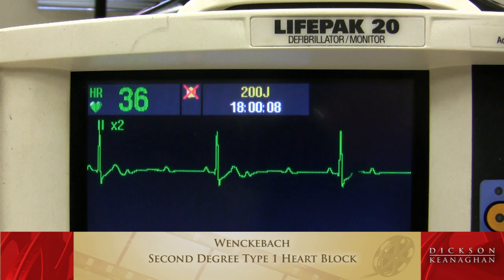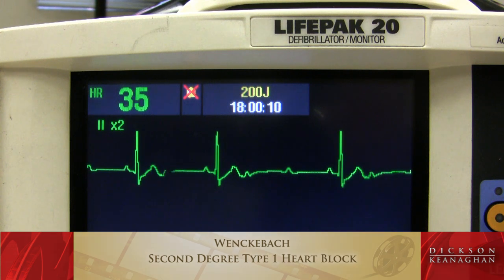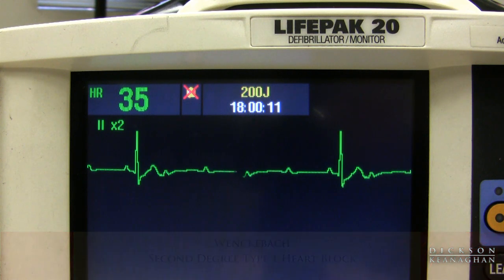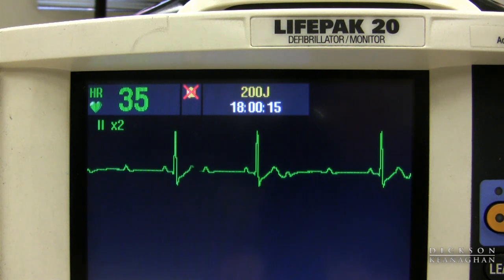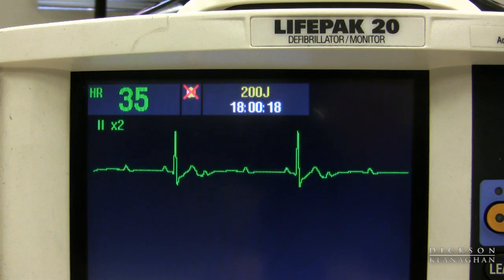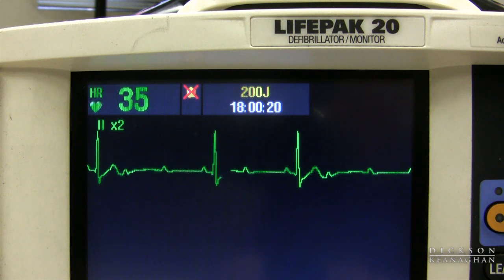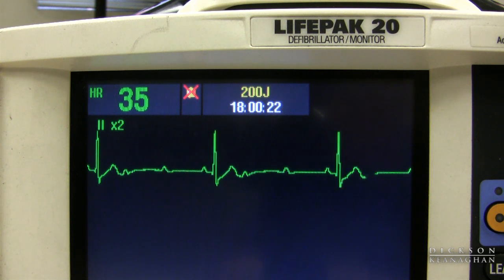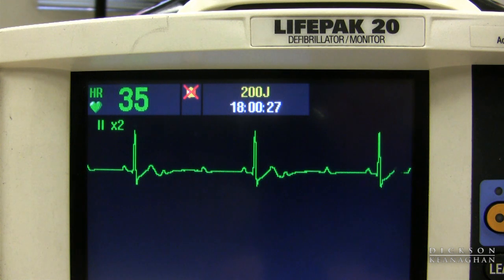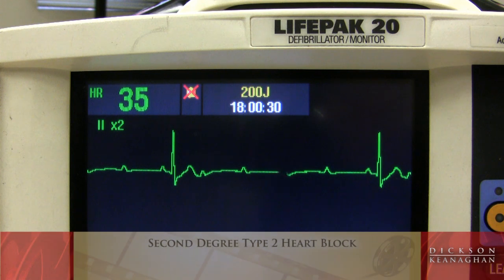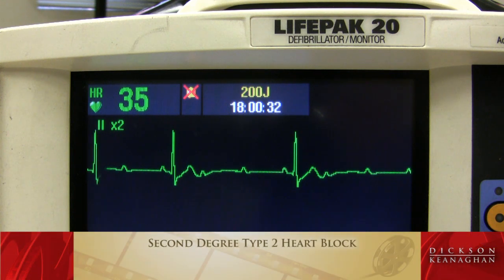In this patient, the rhythm appears regular, but I see more P's than QRSs, so I know it's a heart block. Every time there's a QRS, the PR interval is constant — I say it's married to a P. Second-degree type 2 is the married heart block.